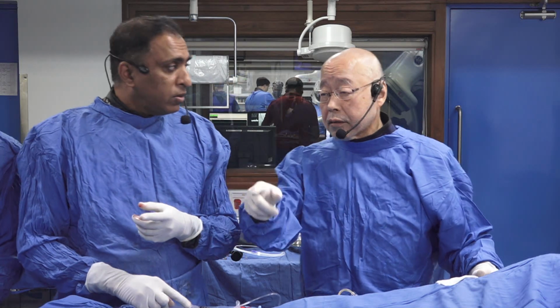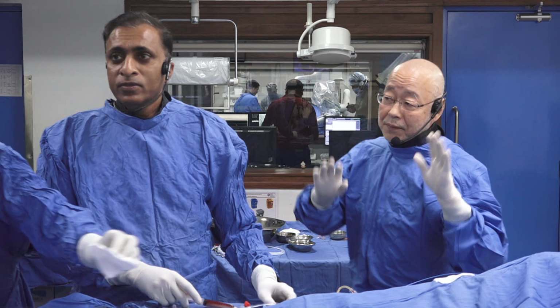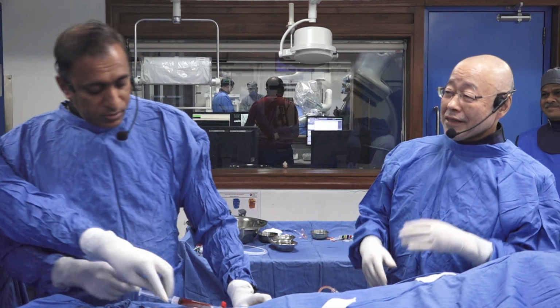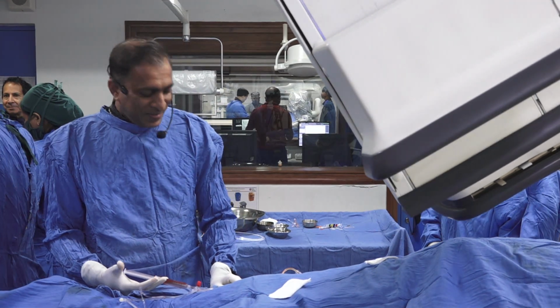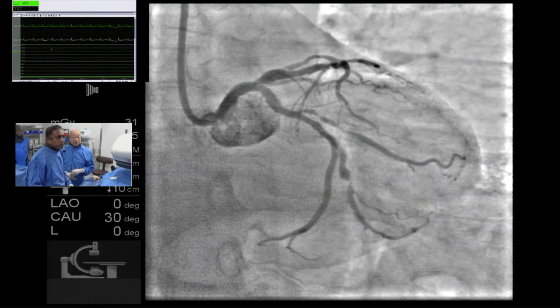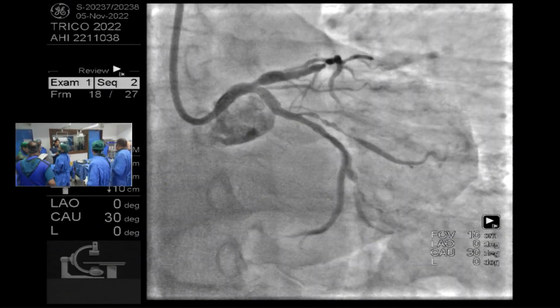Cross the wire to the LAD. Dr. Saito, hi. Dr. Saito, we are on live. Good morning, Dr. Saito. Good morning. I am very glad to come back here. We are honored to have you here. Can I have a wire? Which wire do you have? Run through? Okay, run through.